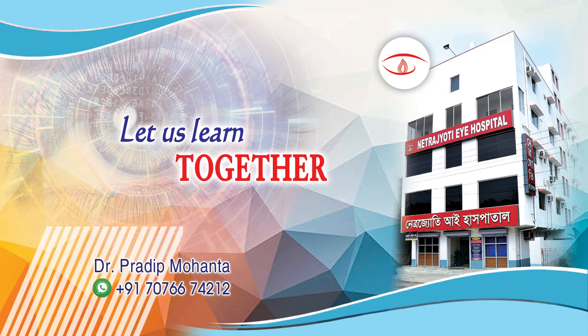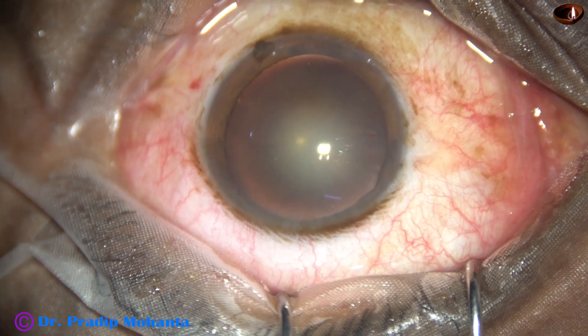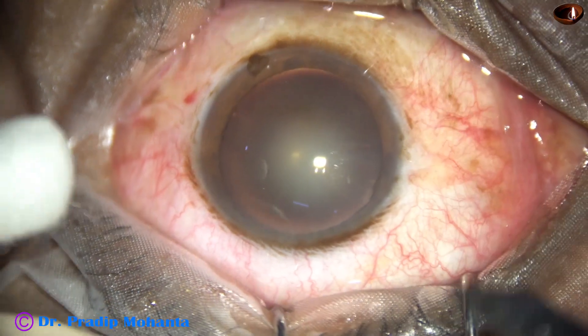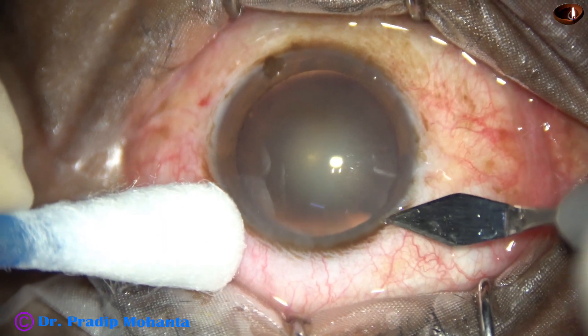Friends, welcome to my workplace at Ranakhat, West Bengal, India. This is a soft cataract; nuclear sclerosis is about grade 2. Let us observe this surgery.